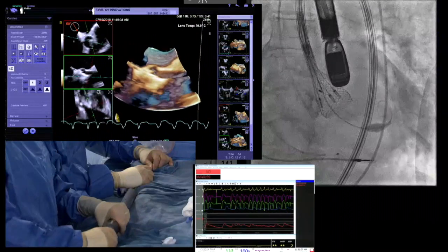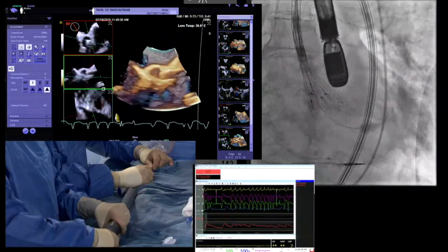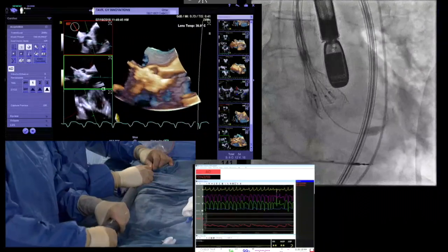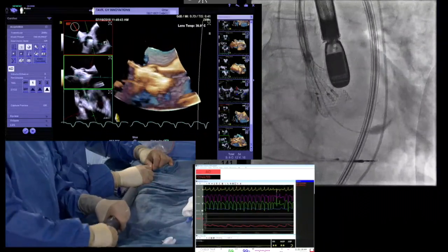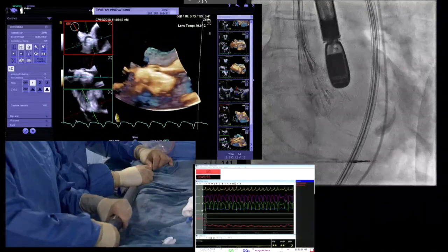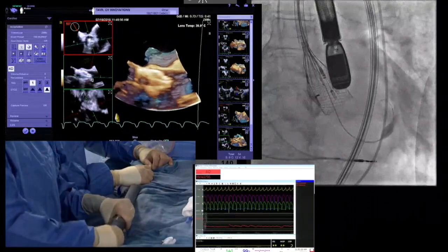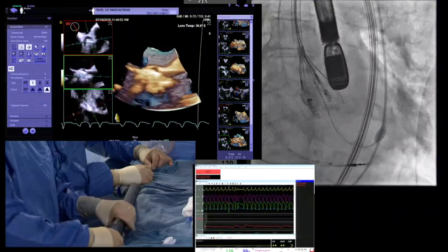You like where we are, Bob? I do. Because now we're starting to make contact. Bill, you think we're making contact there? Yeah, yeah. I thought that it was a little deep on the left. It looks much better now. And our braid density looks spectacular. Now what we're going to do here is slow down the deployment. It looks like pretty good braid symmetry.